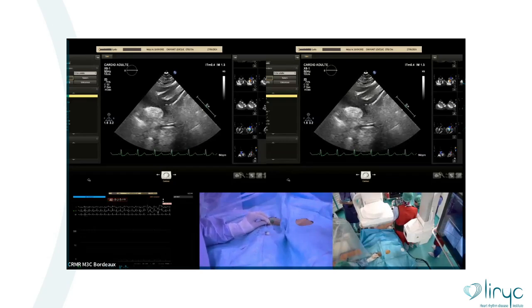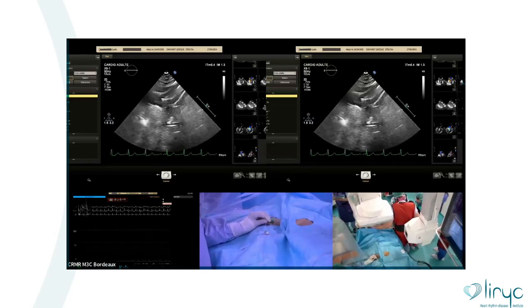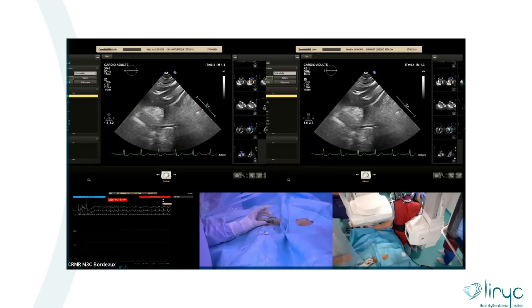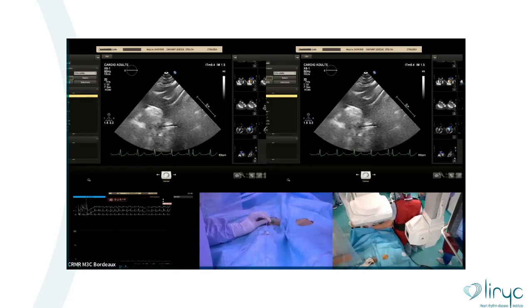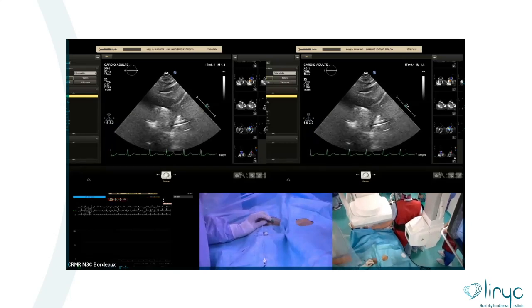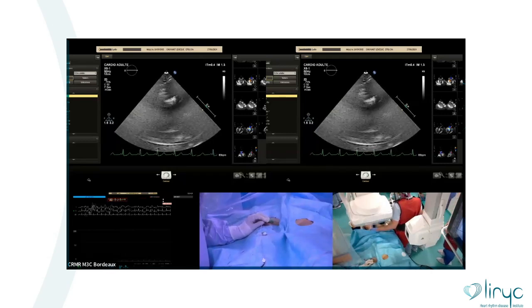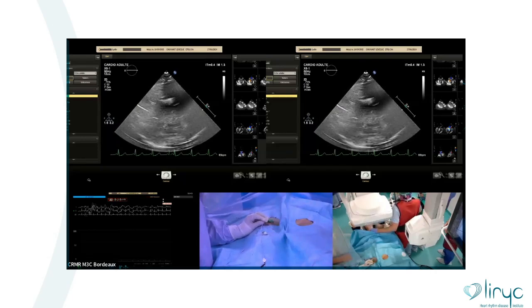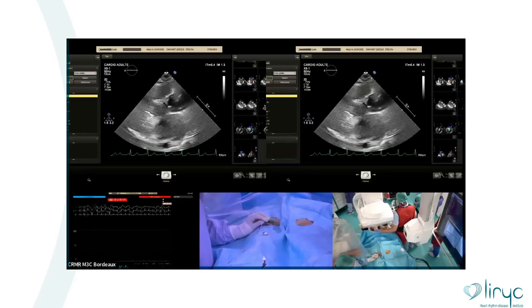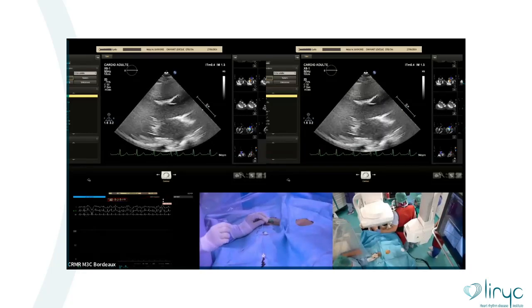The catheter is coming. Now we can try to advance the wire and get it to pass the aortic arch. Advance. Come on. Yes, it passed. Advance the catheter along the wire. Good. Show us the aortic arch, long axis. As you can see by echo, the transthoracic acoustic window is not ideal for this patient, but we'll try. Long axis, take the wire out. Good. Then rotate and advance the catheter.